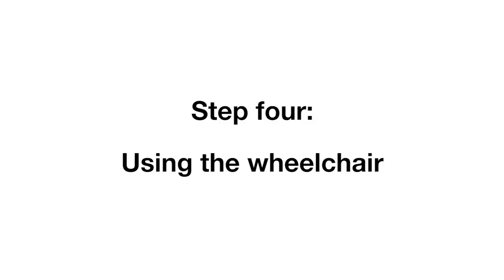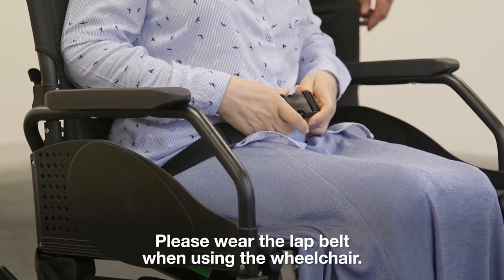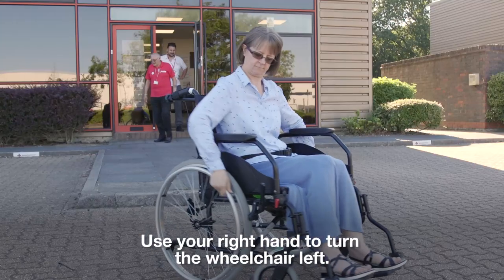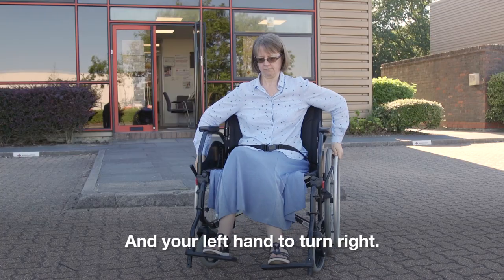Step 4: Using the wheelchair. Please wear the lap belt when using the wheelchair. Release the brakes by pulling the brake levers backwards. Use your right hand to turn the wheelchair left and your left hand to turn right.